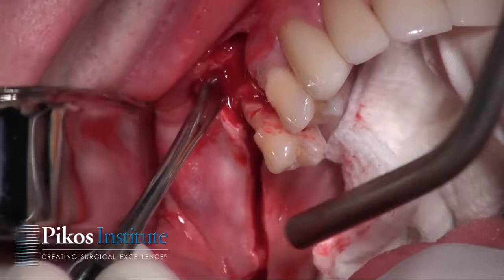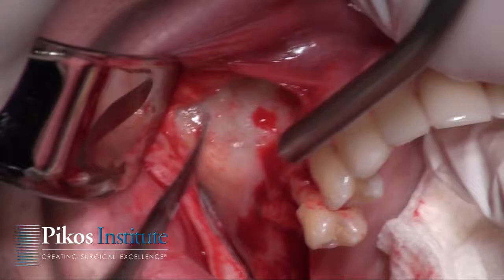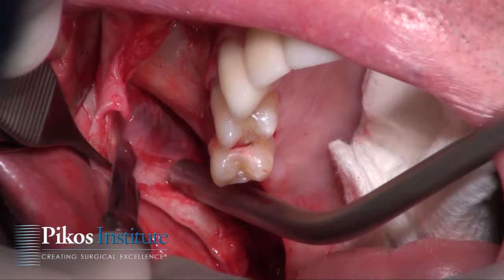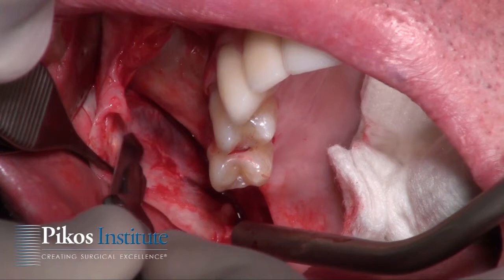This is a full-thickness flap reflection, allowing the buttress of the zygoma to be shown. Our 15 blade is just scoring through periosteum, and we're doing this right up front. Why? We are placing implants here, and if we're also doing lateral augmentation as shown in previous modules, we have a greater volume to close around.